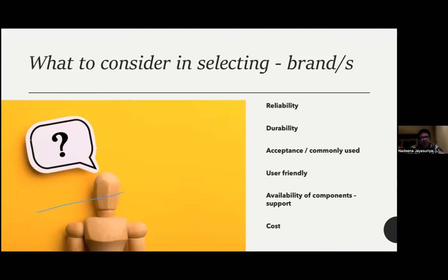And in implants, we need to tighten screws. There's a lot of mechanical parts as well. So the quality of these mechanical parts, how easily it fits in, all those things are very important when you think of the quality of a product.